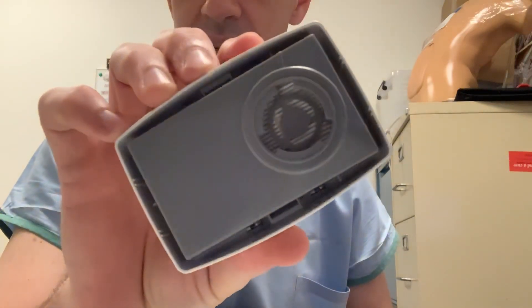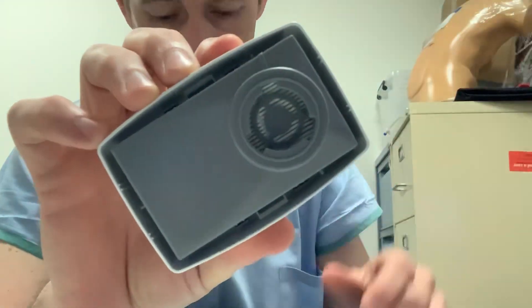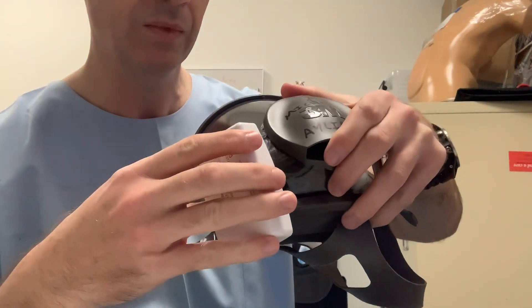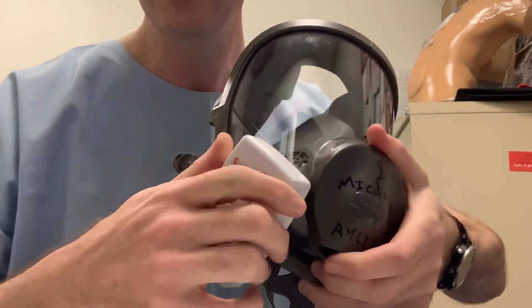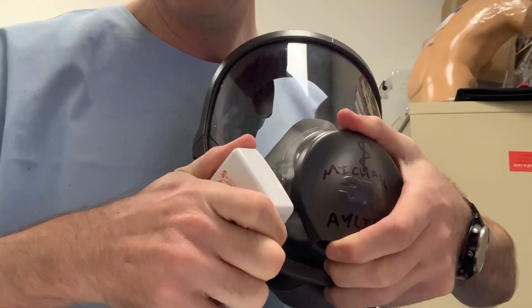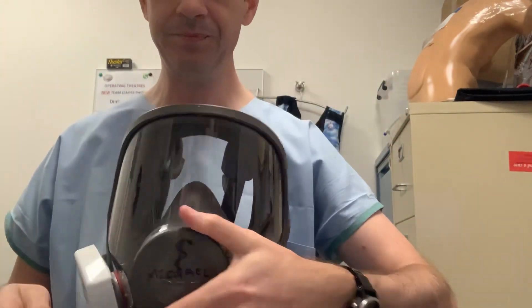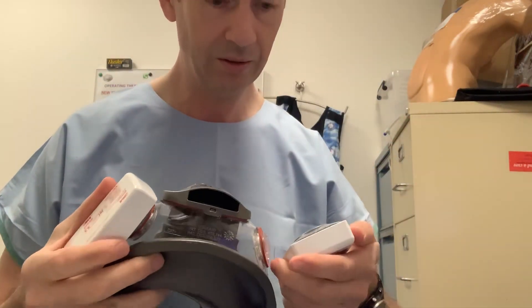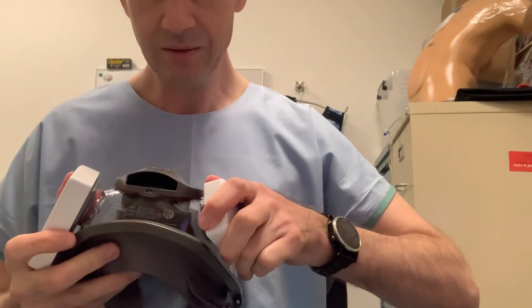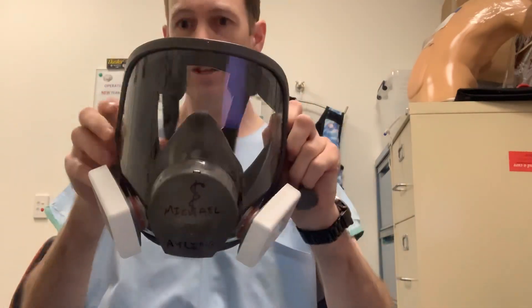If you look carefully, there's one narrow and two wide lugs on the filter. Match them up with the lugs on the respirator. Narrow to narrow, wide to wide — press firmly and twist gently with firm pressure until it locks into place. Place the other one on as well, pressing gently until it locks.